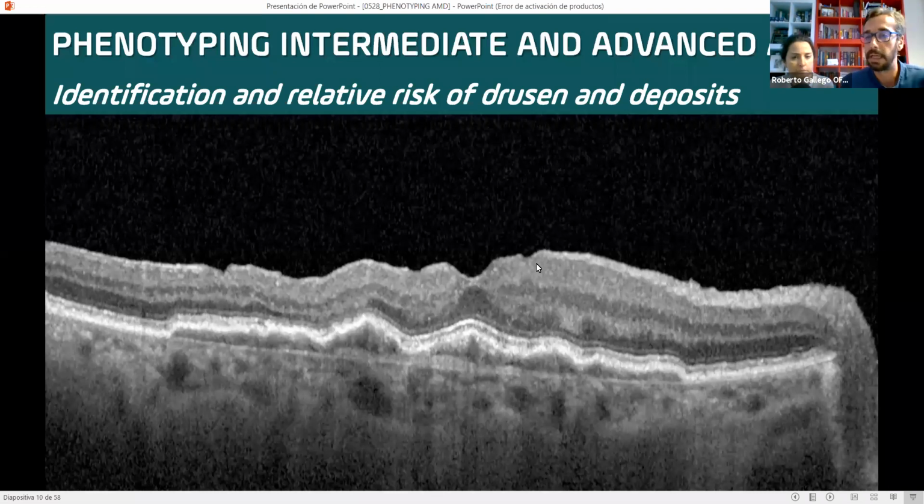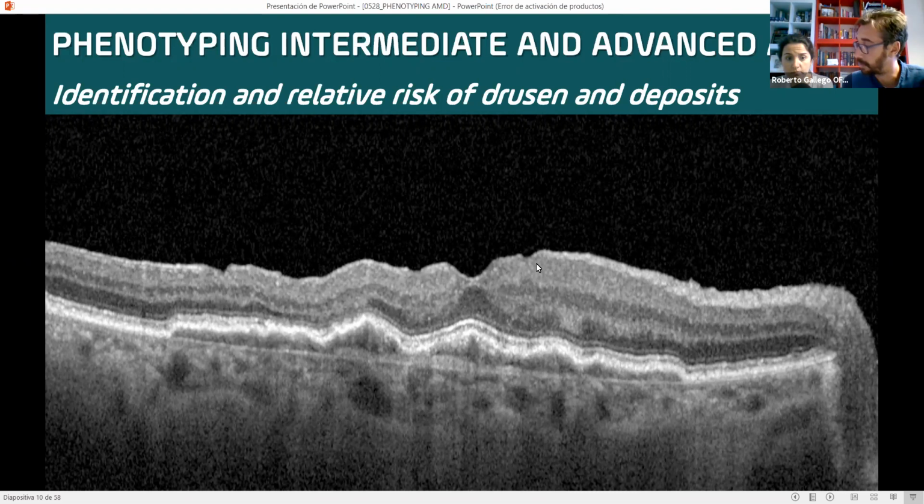So we were taking a look at these images before. What do we see there, Rosa? So we see detachment of the retinal pigment epithelium. It has been described as double layer sign. When we see this detachment, normally it's quite shallow, not really. Shallow is a beautiful song also. Yeah. So how we know it's detached, because we see content below the hyperreflective line of the RPE, and also we see the Bruch's membrane here.